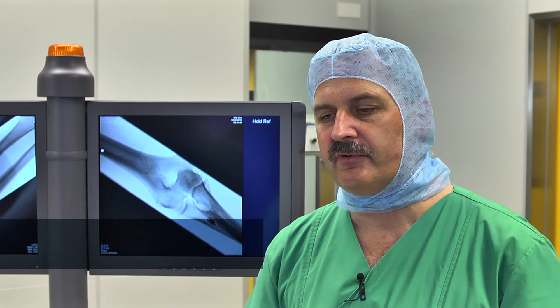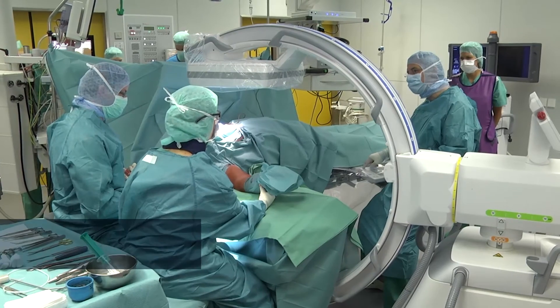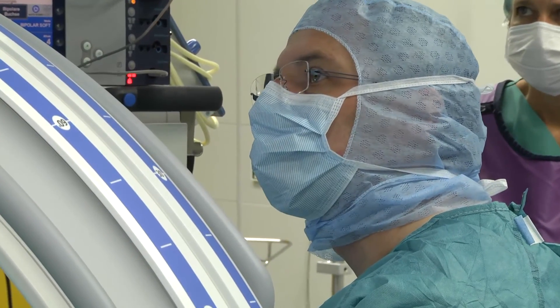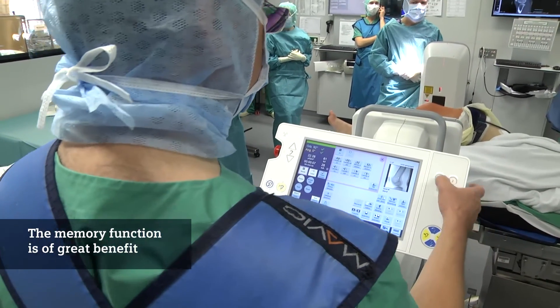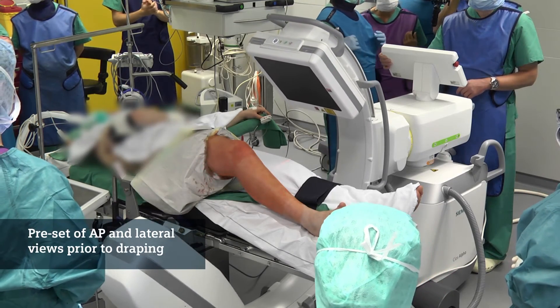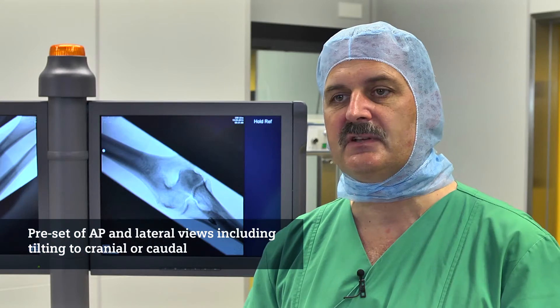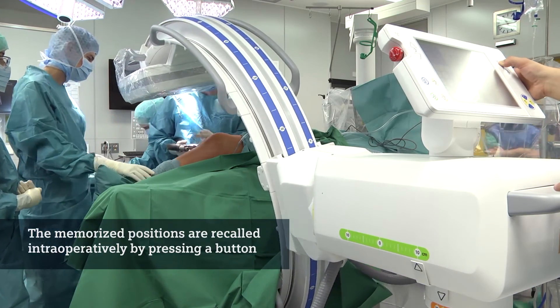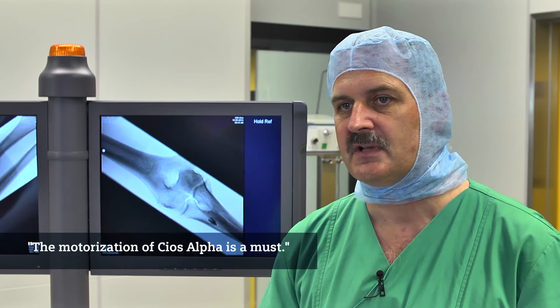The motorization of the system is a very good tool to speed up intraoperative imaging and to provide precise imaging. When I use the motorization I can control it from the OR table, which reduces the need to talk to other persons and describe what they have to do. What I really like most is the memory function. For a spine or long bone procedure, the basic imaging is AP and lateral. I can set up a very good AP projection — including tilting cranial or caudal — and a very good lateral position in a dry setting before draping the patient, store it to the system, and recall those stored positions during surgery. This is a huge speed-up because I don't have to adjust the system as often. Motorization is really a must.